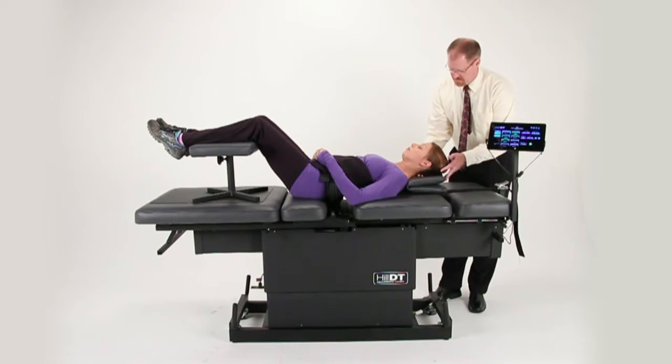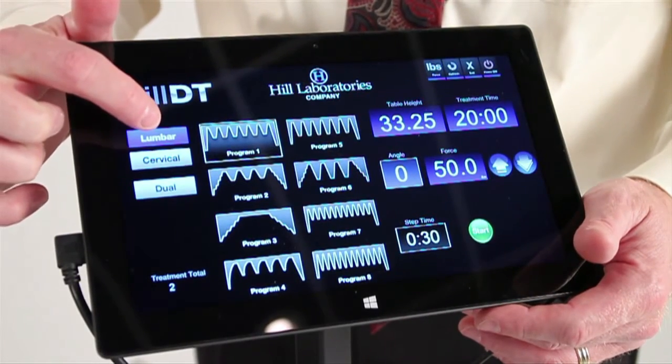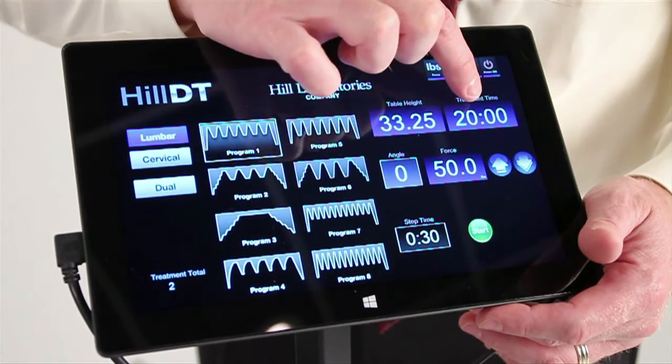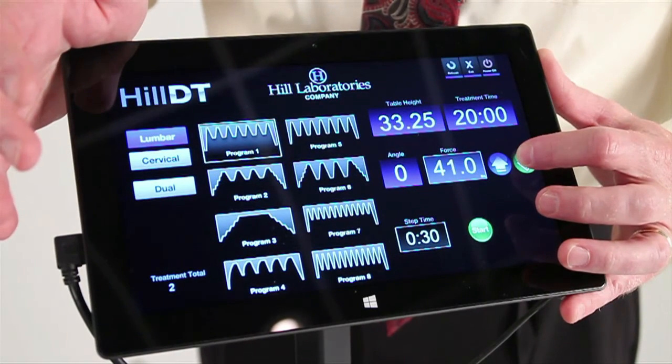Insert the pillow under the patient's head and enter your treatment settings using the touchscreen. From the treatment buttons, choose lumbar and select from programs one through eight. Enter your treatment time and force by first selecting the box and then entering your settings using the up and down arrows.